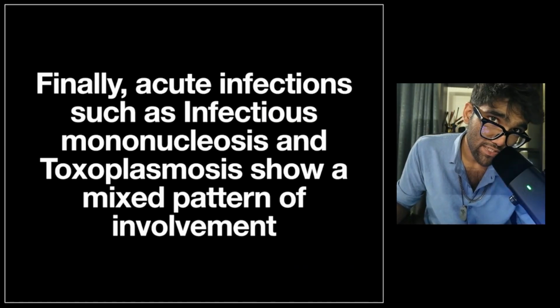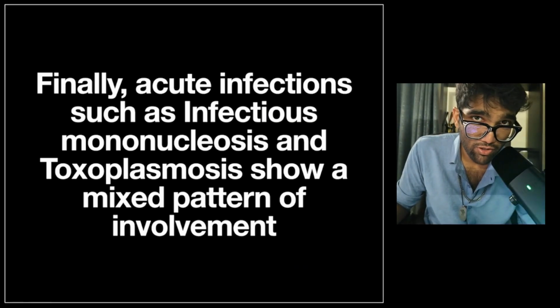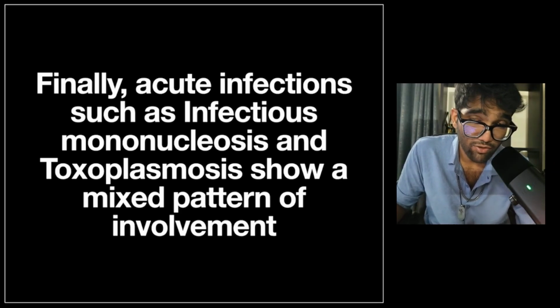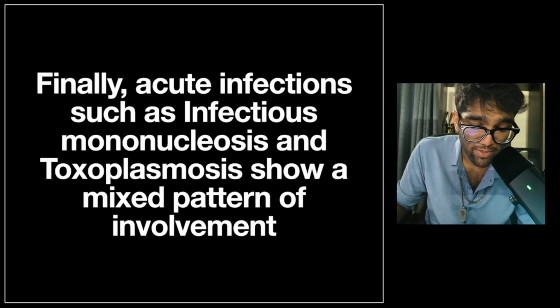And how would I differentiate between them? By using your C4D staining. Again, the clinical context is important. Without the clinical context, it would be difficult to diagnose Kikuchi-Fujimoto.